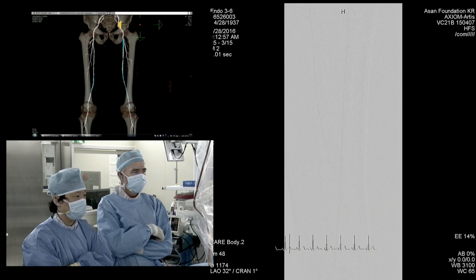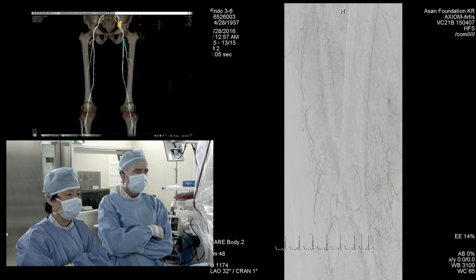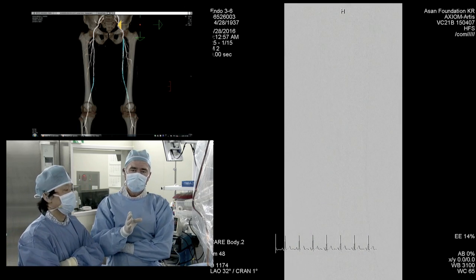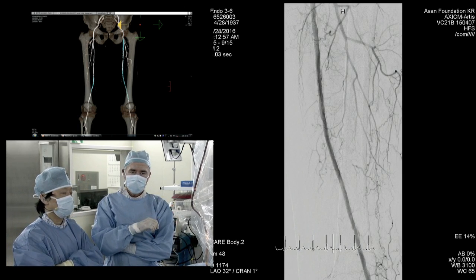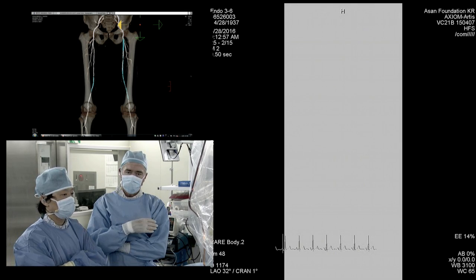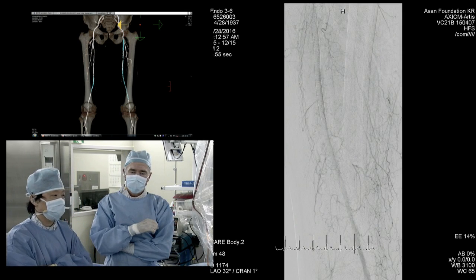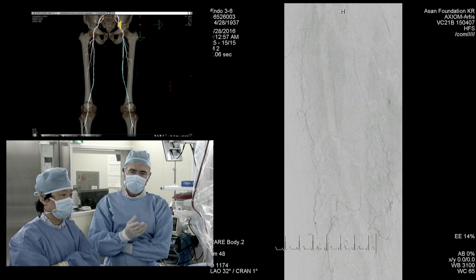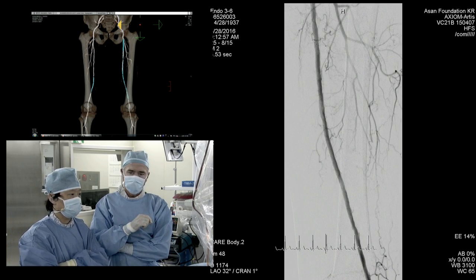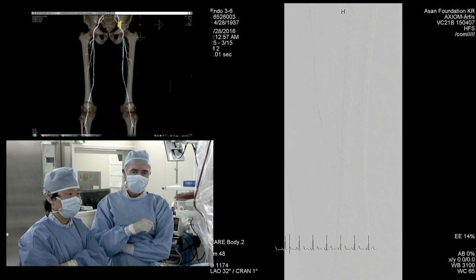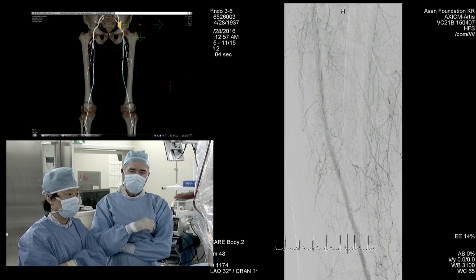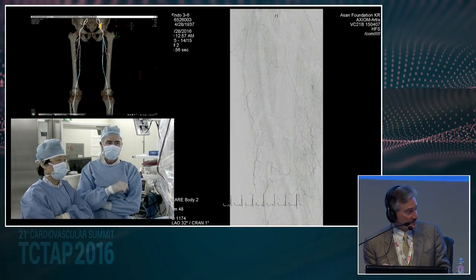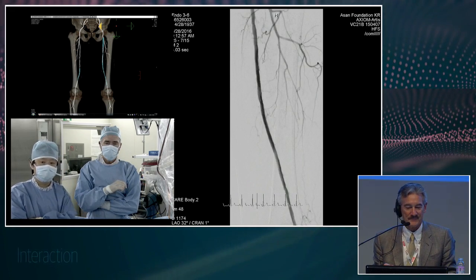Welcome back John. We went ahead and did a prolonged inflation in the distal stent area with a 5-millimeter balloon and ended up with a nice result — just very minor dissection outside the stent and beyond in the popliteal artery. Typical DCB result. I'm very happy with it — no need to stent. We checked distal below-knee vessels to ensure no evidence of embolization, and everything's fine. Looking at the entire length of the stent, it looks good. We did three-minute inflation with a 5-millimeter balloon and three-minute inflation with a 6-millimeter balloon. If you don't get a perfect result, you can go back and do even longer inflations — we went back with the Admiral 5-millimeter and did a five-minute inflation, which gave a beautiful angiographic result. In this case we avoided a stent in the popliteal artery, which is desirable. If you're going to use DCB, you want to commit to it, do long inflations, and try to avoid additional metal.